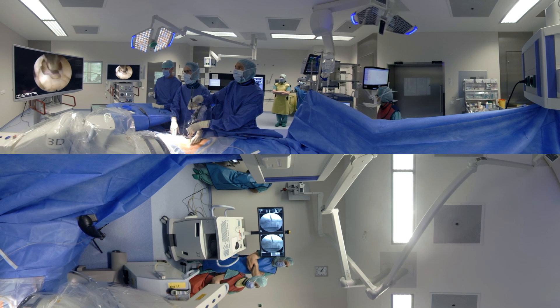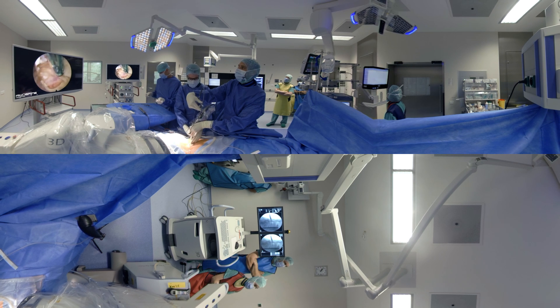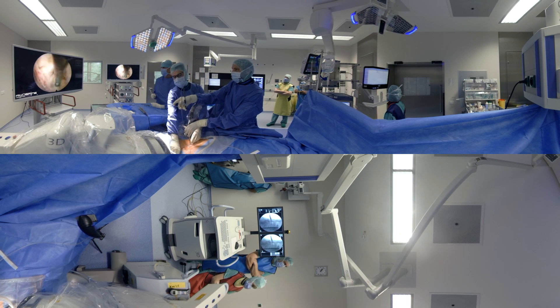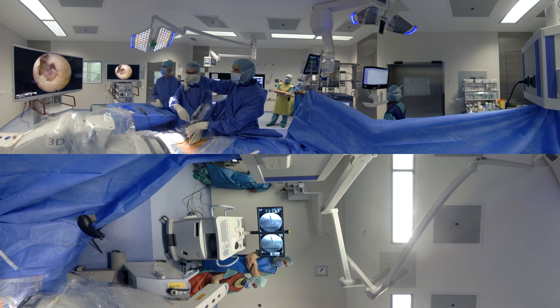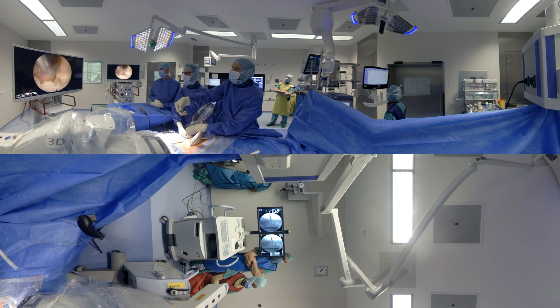The neural structures are right there and we will see them perfectly, which makes the procedure very safe. We will do everything under full visualisation of the neural structures. Our plan is to fully visualise the nerve root and then go laterally of the nerve root. Let's see in this case if we can limit the procedure to a sequestrectomy, which I would prefer rather than a full discectomy — that would have a lot of advantages for the patient.